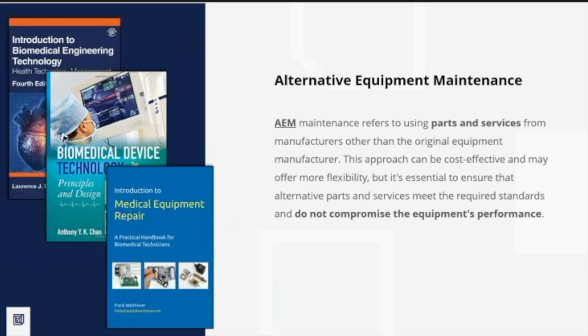But the key here is you don't want to compromise the equipment's performance. If you're doing things that might make it unsafe, might put more risk on a patient, like using a subpar part or changing the frequency, they say to do something every year and you decide you're going to do it every 5 years, that's probably not going to keep that equipment running properly. But if there's data behind that, you could. And that's what we're going to talk about as well.